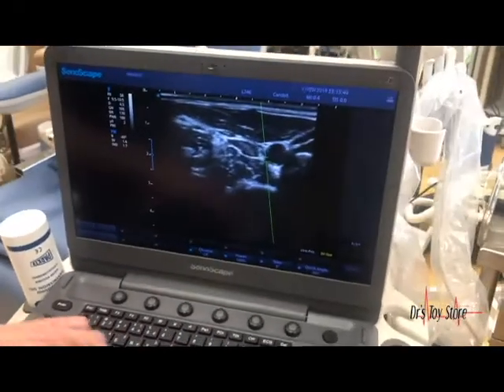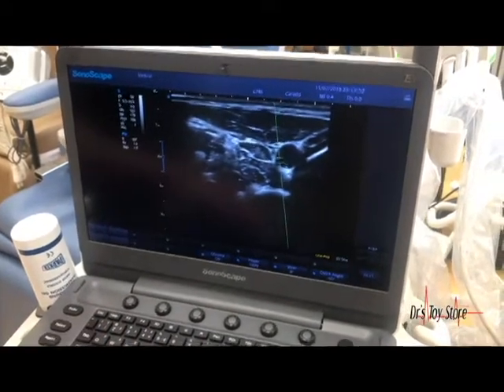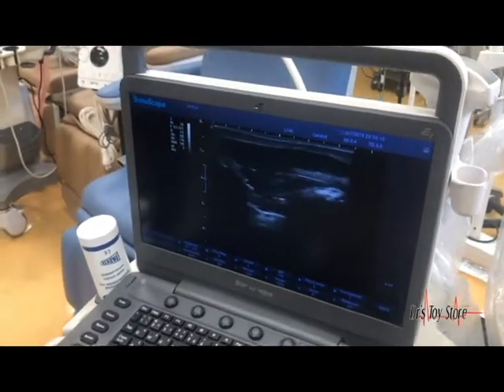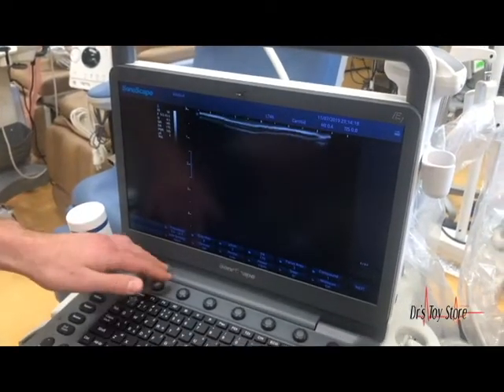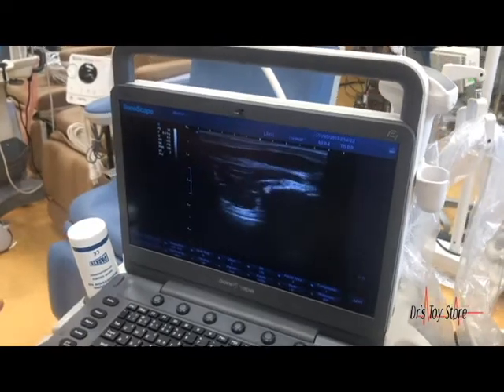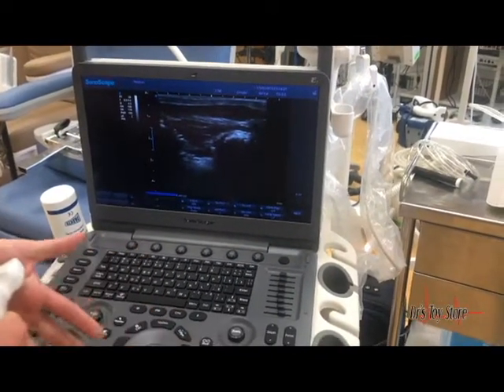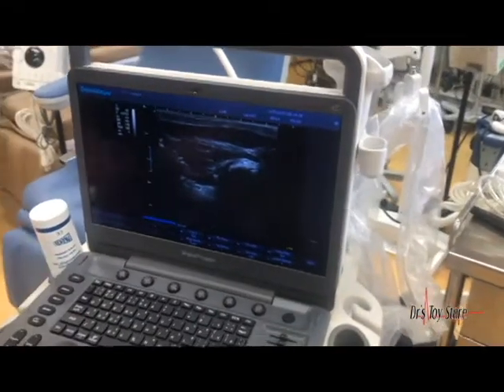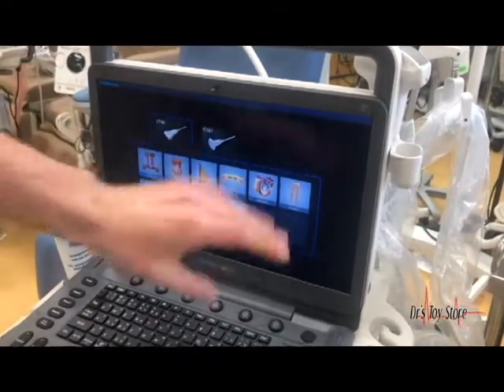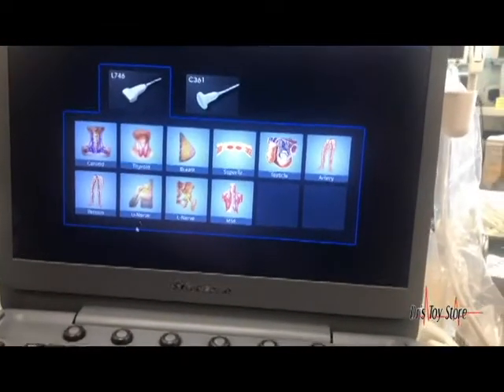Say you're doing an image right here and you're not in the correct exam — you can go ahead and freeze your image, then go to probe and you can see all the different exams that are pre-programmed into the system. It's extremely versatile.